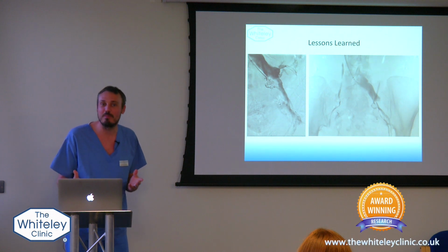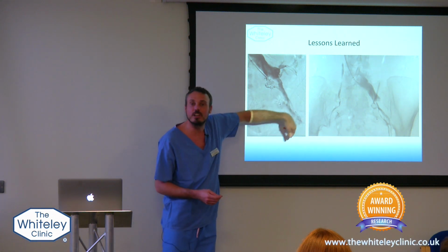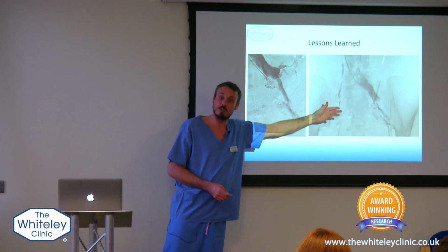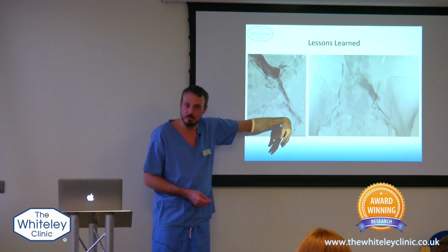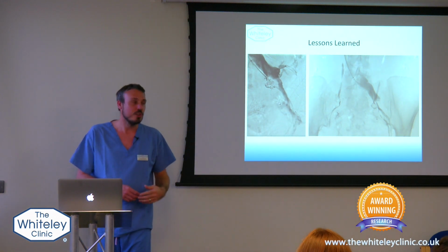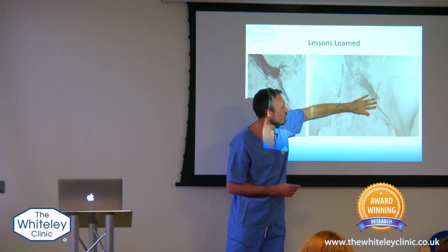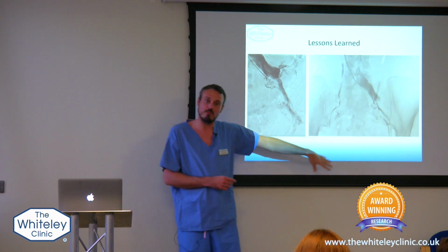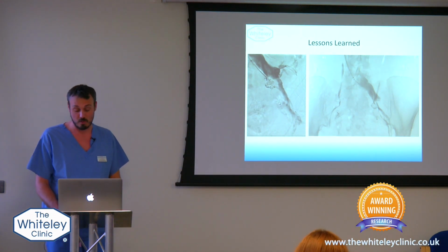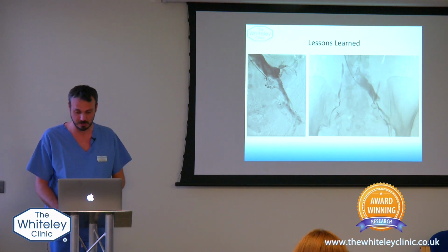And that's probably why the patients didn't get any better, because of course they've got other veins coming around that are still draining those organs. But as well as draining, that means they're feeding those veins, and if the reflux is still there, then the reflux still goes on. So actually blocking it off up here is no good. We need to get further, and we need to get deeper into those veins to get a more durable, lasting response.